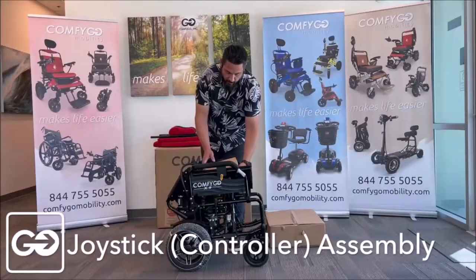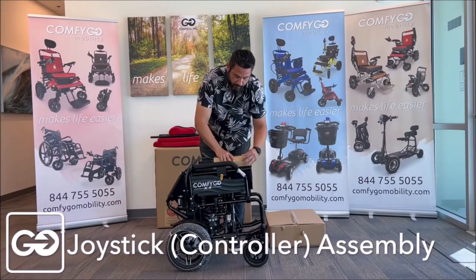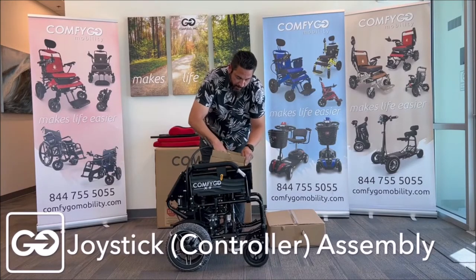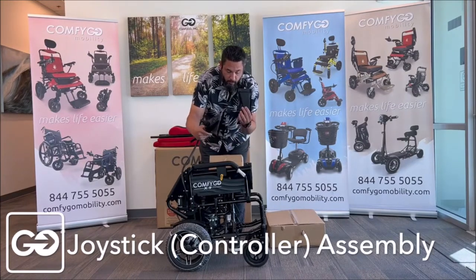We have the X9 out of the box. We should have our X9 model here and our controller on top. As you open up this box, you're going to see we have an analog controller and a universal toolkit.